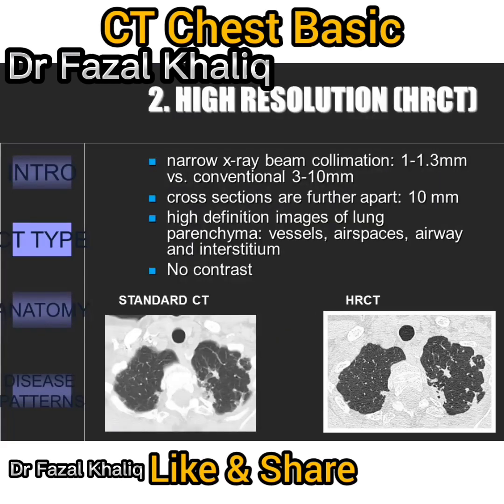In high-resolution CT, transverse images of thin slices of lung between 1 to 1.3 millimeters thick are obtained. These are obtained at non-contiguous intervals, usually 1 to 2 centimeters apart throughout the whole lung. The computer then reconstructs the images to give high spatial resolution. This process results in images that show fine detail, but only 5 to 10% of the lung is sampled. This type of sampling is appropriate for evaluating diffuse lung disease. However, focal lesions may require more images.